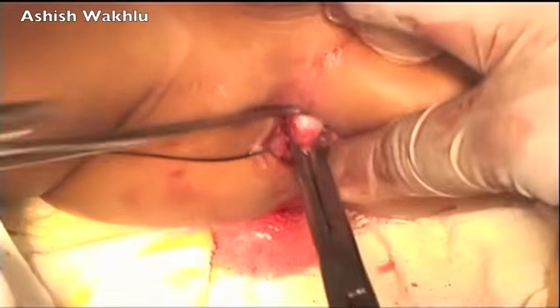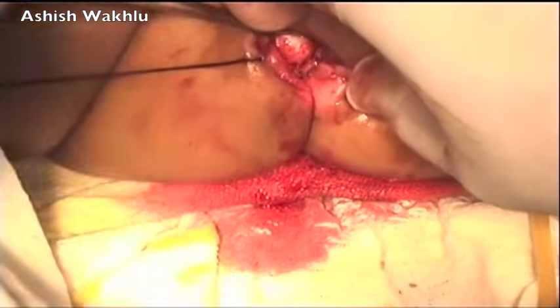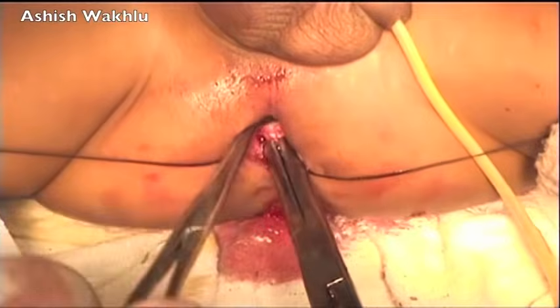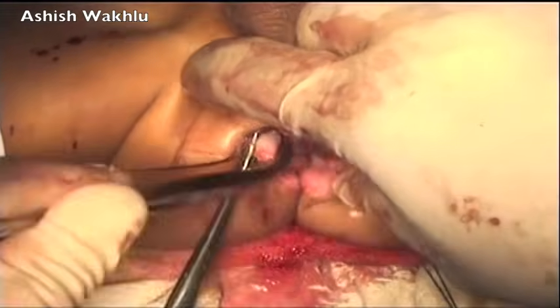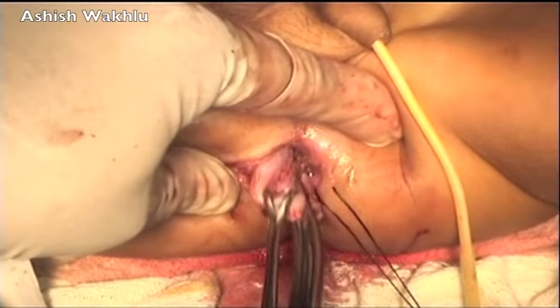This requires you to work against the front to back paradox, but it can be done with a little practice. Due to the large dilated rectum, a little bit of pulling is required to bring the fistula down to the perineum. However, with a little traction, we were able to get the tip of the rectum out to be sutured to the skin for the anoplasty.